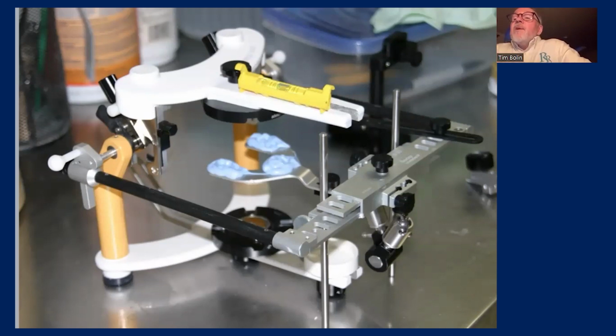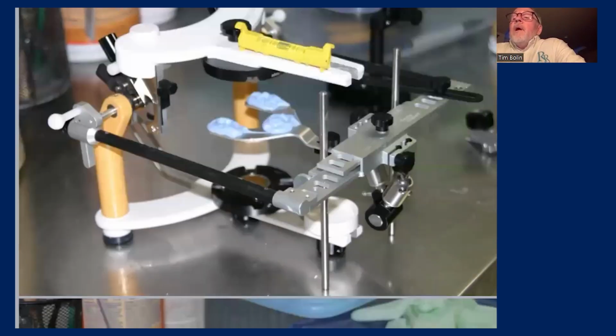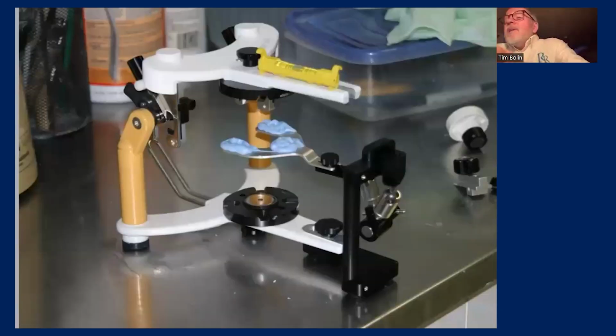So we're using the anterior pins. There's two methods of doing this. We're using the anterior supports to level the case off, or the facebow transfer off on the anterior section. This is the registration joint holder, and this is the easiest way to transfer this to this particular articulator. This joint holder simply locks into the lower member of the articulator.